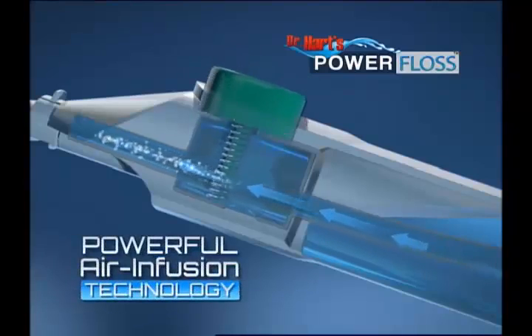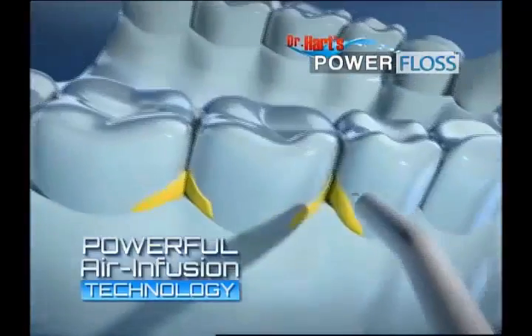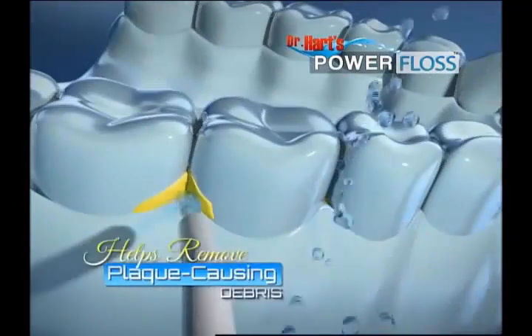The secret is air infusion technology. When you press down, the air propels the water in a powerful stream that helps remove plaque-causing debris.